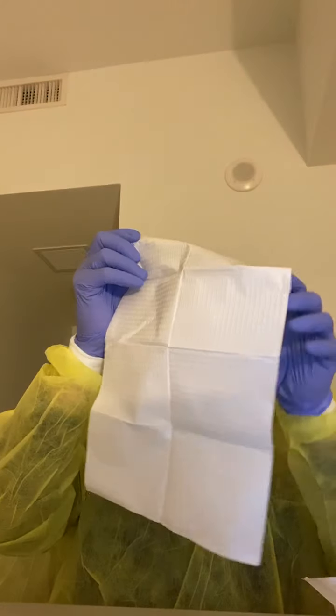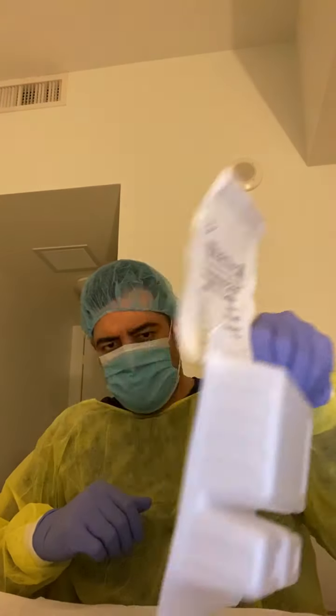The first thing we do is take out this piece of gauze, and we're going to pour all of the things in there. Once our kit is empty, with this hand, we're going to place the normal saline in it.